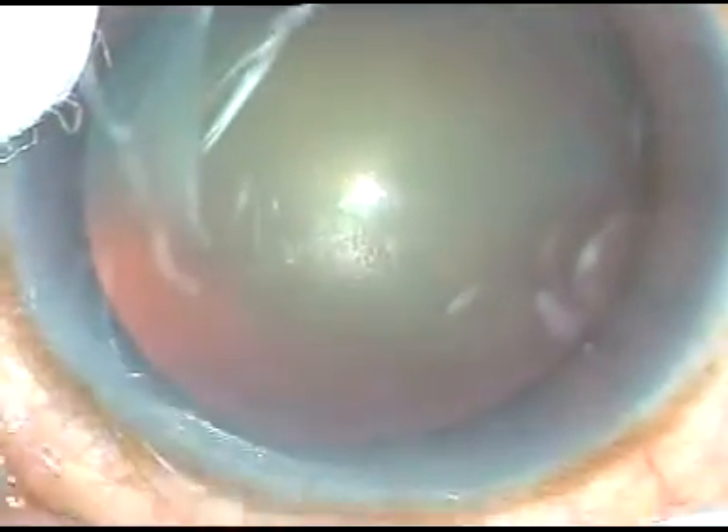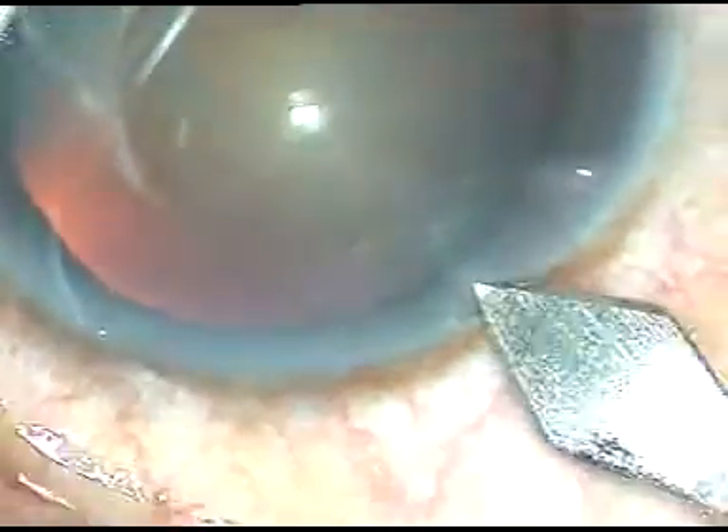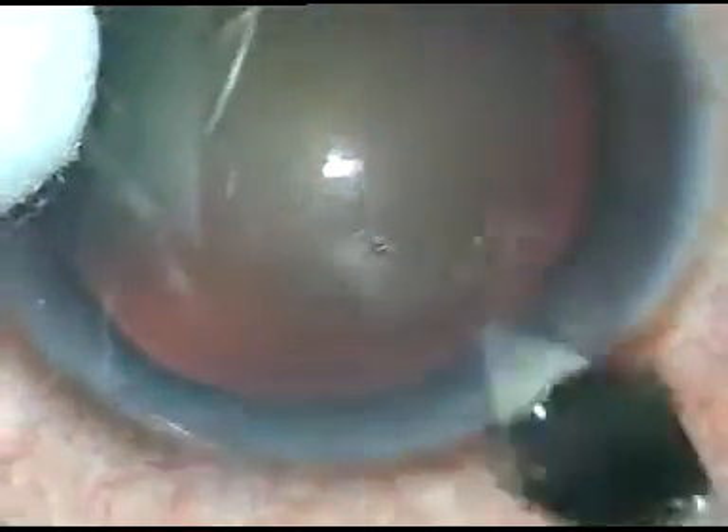Dear colleagues, this is phacoemulsification of a cataract with grade 3 nucleus sclerosis. This is the main incision. A 2.8mm keratome has been used to make this main incision.